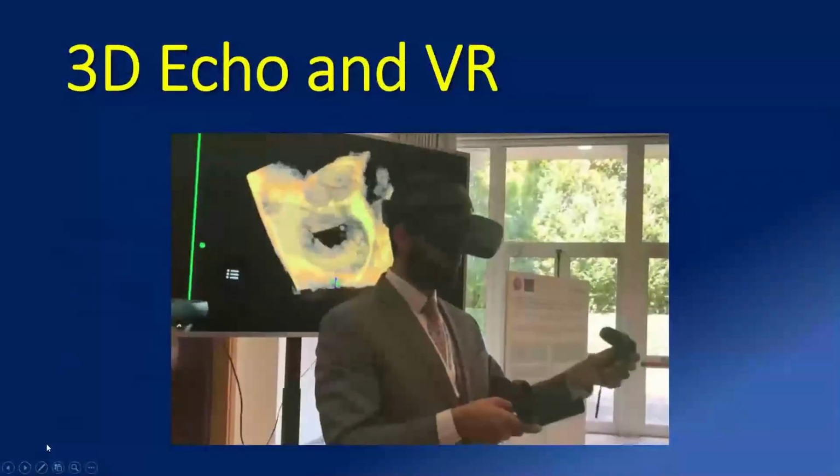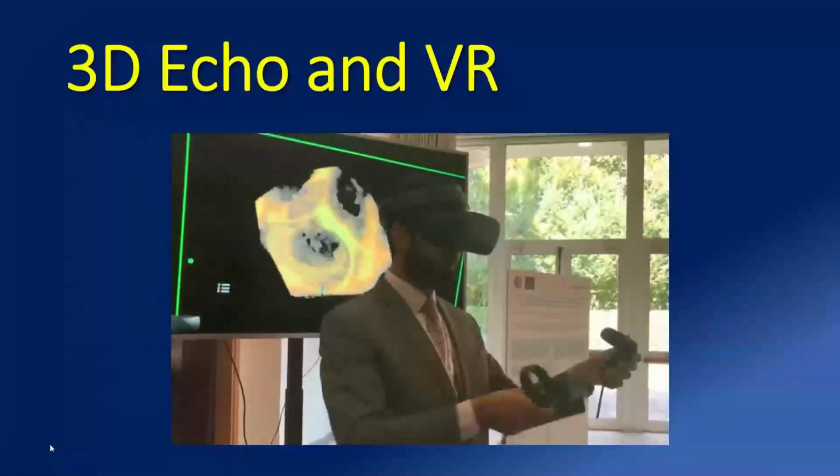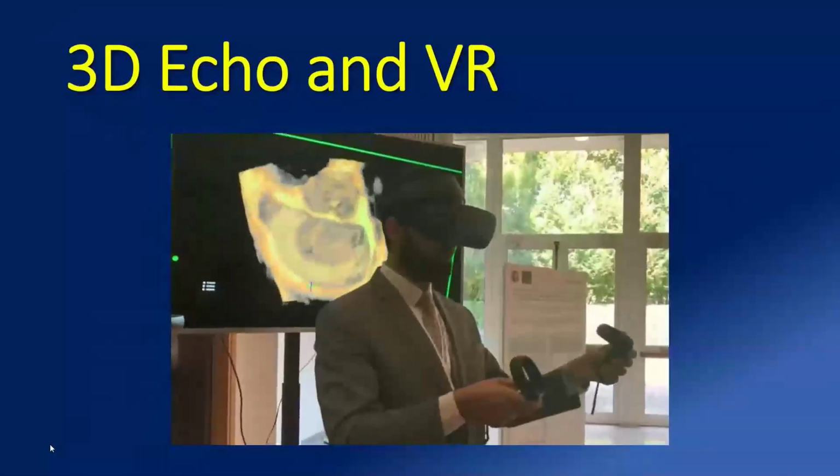3D echocardiography can also be used in virtual reality, so we can navigate the 3D datasets.